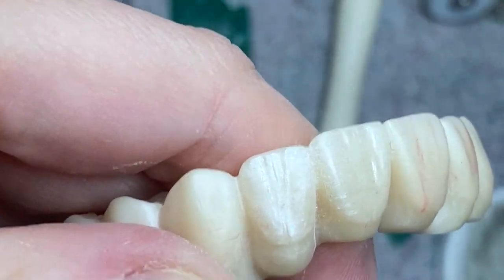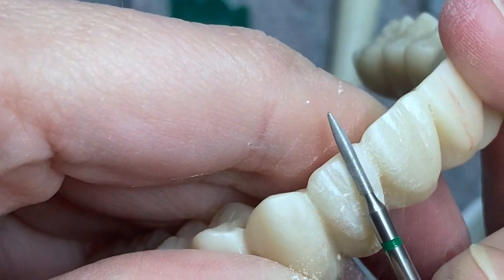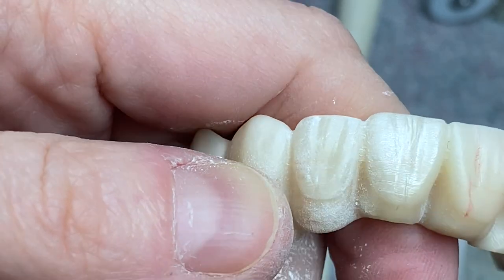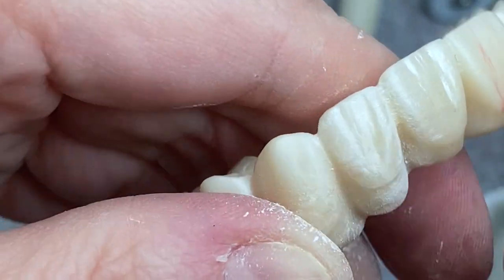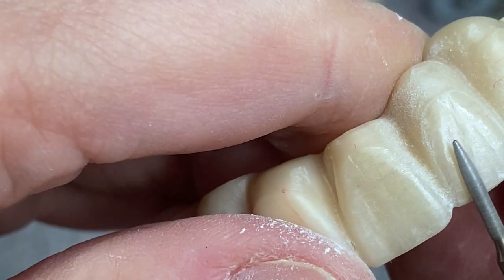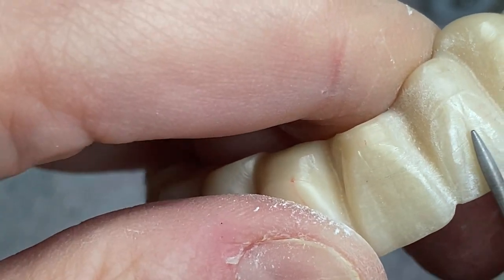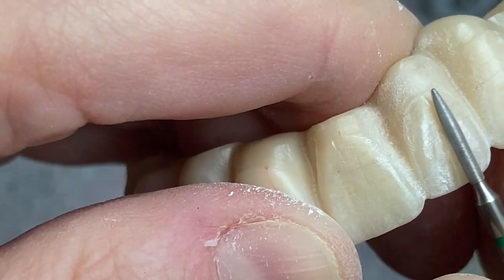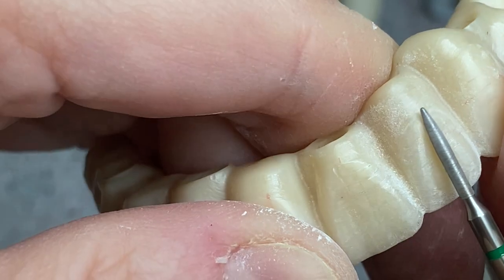If you need to grind out a good amount, then you can also speed it up a little. That's what you get when you increase the speed. But then low 15 for small details. The precision of how you are grinding depends highly on your speed — if you have to grind a lot, do it on high speed, and then always finish on low speed.